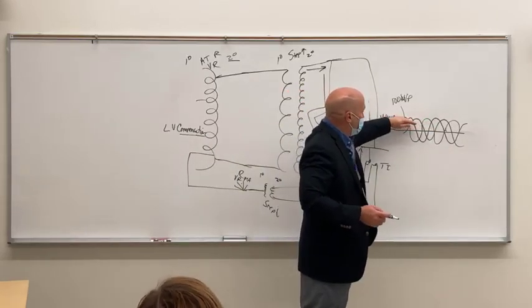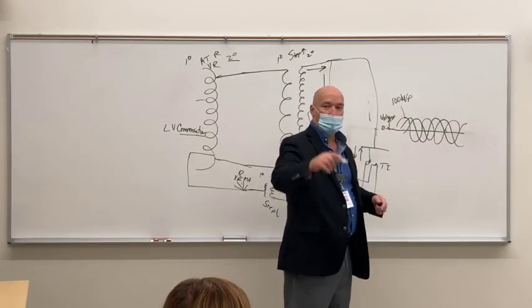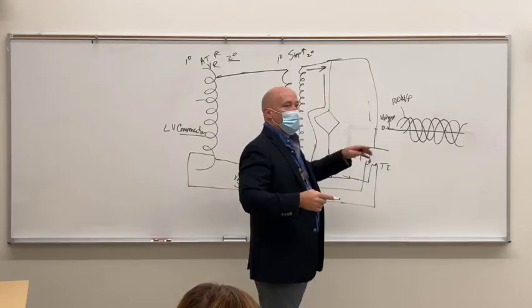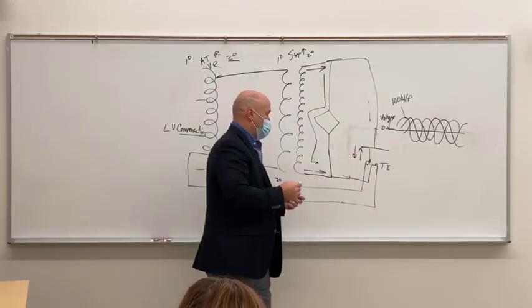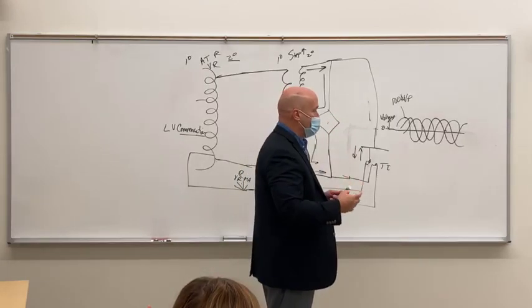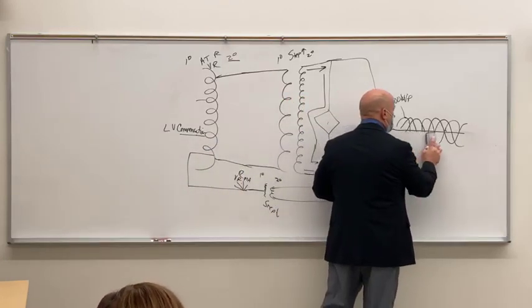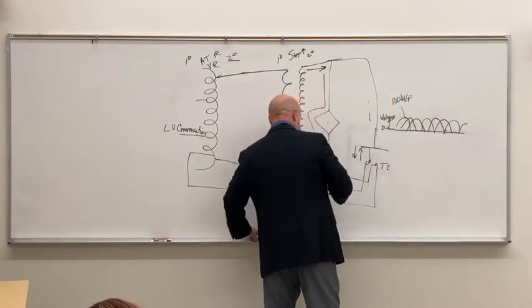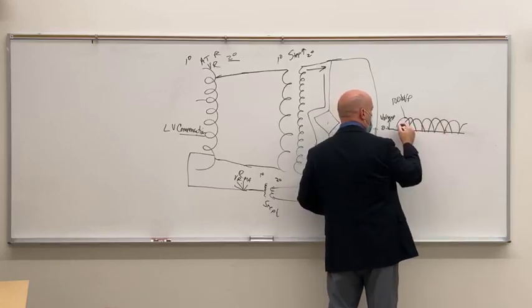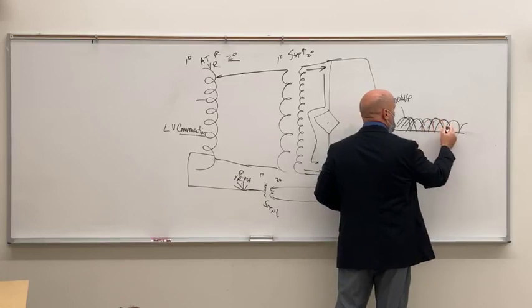But the waveform becomes much more constant, right? It doesn't go all the way down and stop making x-rays. It becomes much more constant. We're still unrectified at this point, but if we run it through a rectifier bank that utilizes at least 4 rectifiers, then not only can we change this from alternating current to direct current, but we can also flip up those negative pulses and overlap them like that, okay?